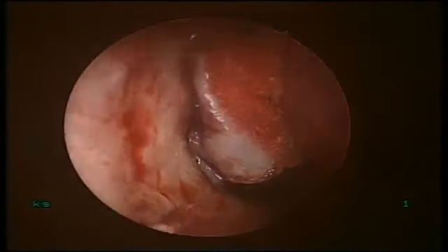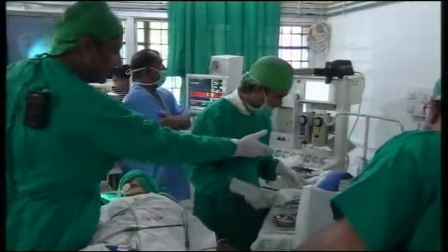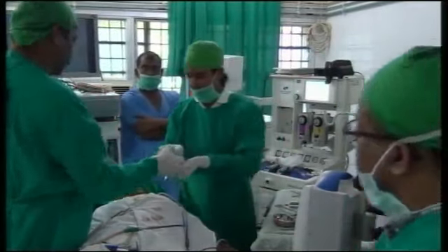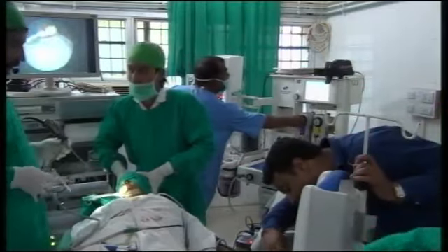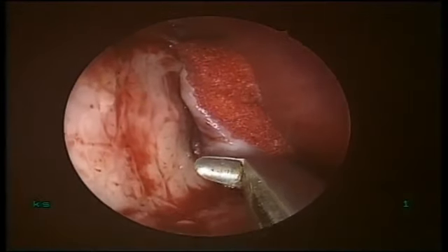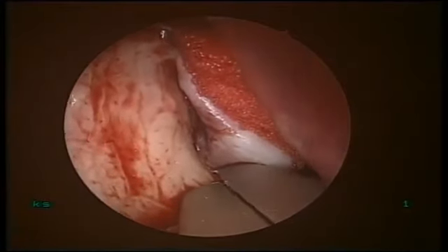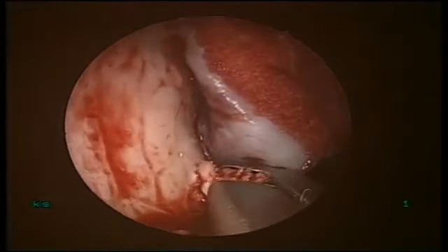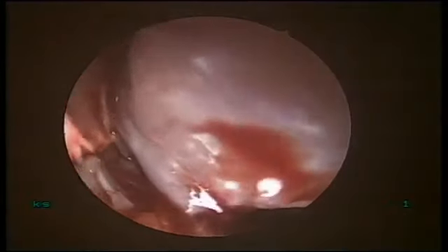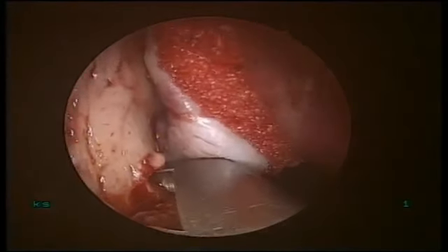Okay, now this is the nasolacrimal prominence. Now the first thing is, like you said, if somebody asks how to locate the sac, our approach is not to look for the sac first. Our approach is simple. See, this is the nasolacrimal duct prominence. Go behind it. With Kerrison punch out, and you are right on the nasolacrimal duct.